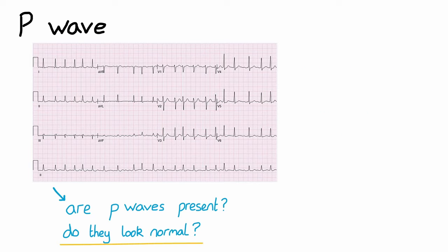This ECG shows a prolonged PR interval since it's over 0.2 seconds, or 5 small squares. Having a constantly prolonged PR interval is called first-degree heart block, which is caused by the AV node conducting electricity slower than normal.